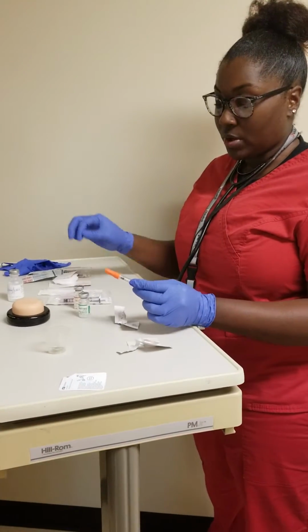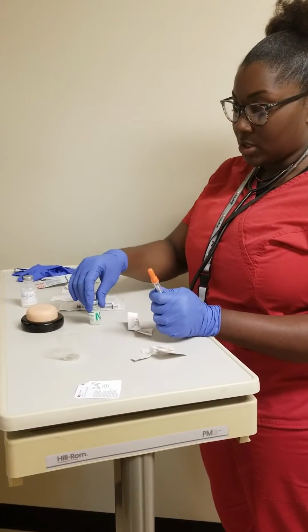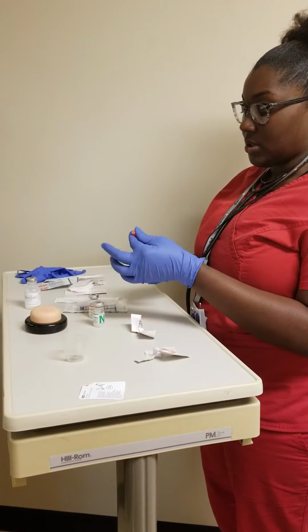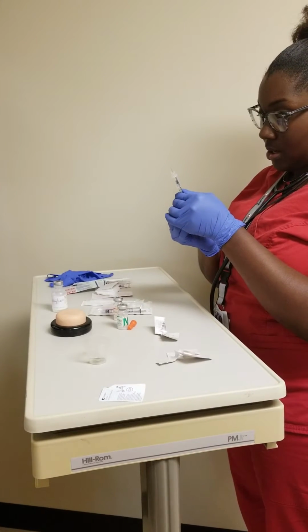The physician has ordered 10 units of insulin. He wants 5 units of the NPH and 5 of the regular. I will take my insulin needle, and I will pull it back to 10.